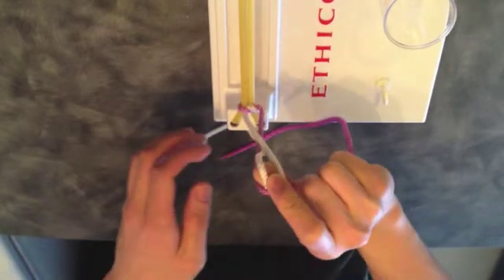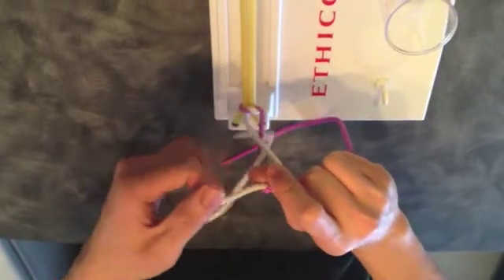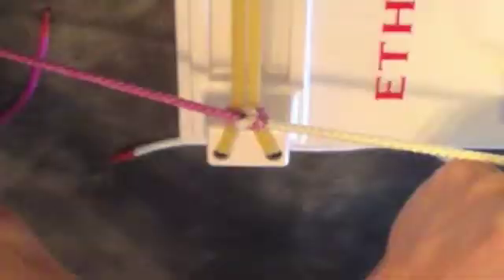Rotate your wrist to push the strand through the hourglass. Re-grasp the strand with your left hand and separate your right thumb and index finger. Cross your right hand over your left hand to secure the second throw.